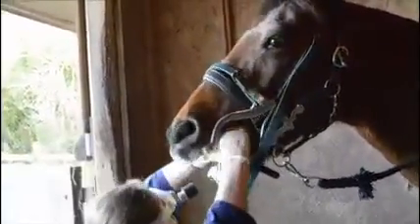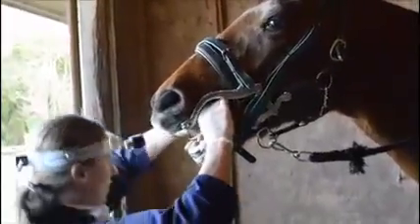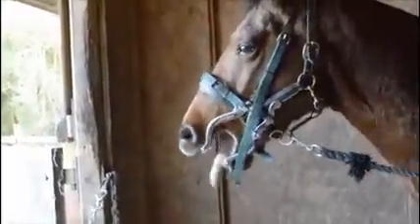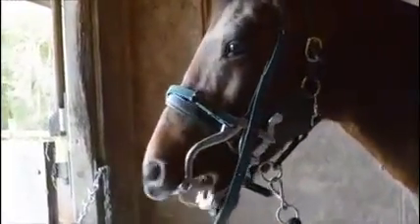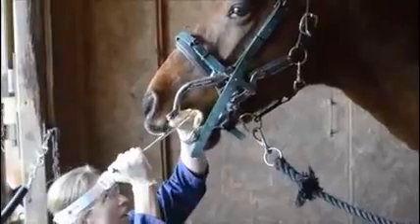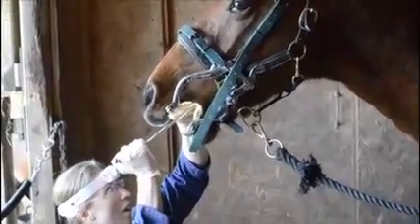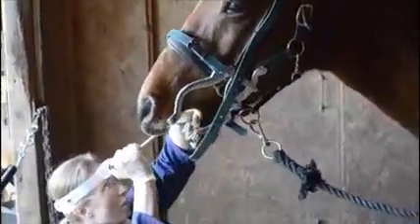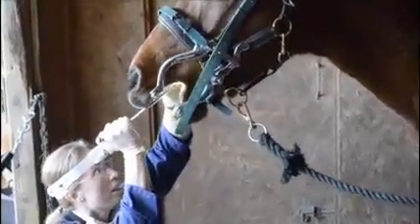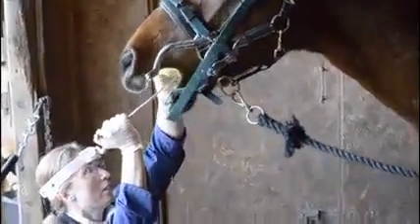I'll just grab the mirror and have a double check of that fracture now we've treated that. Just have a look with the mirror, my friend. That was good. Tissues are all fine around it. It's not trapping any material. That's good. Lovely.